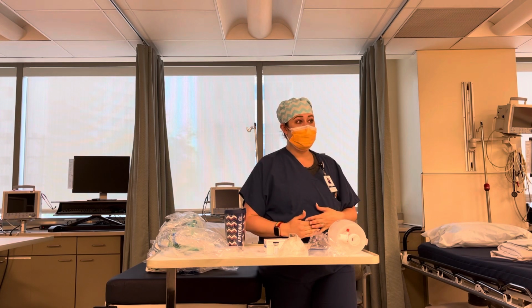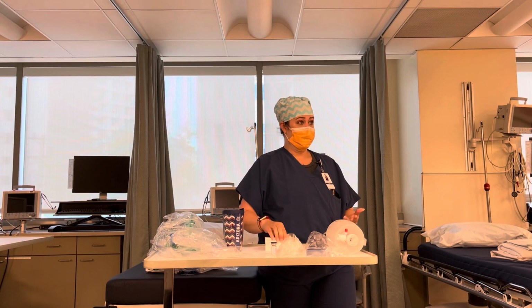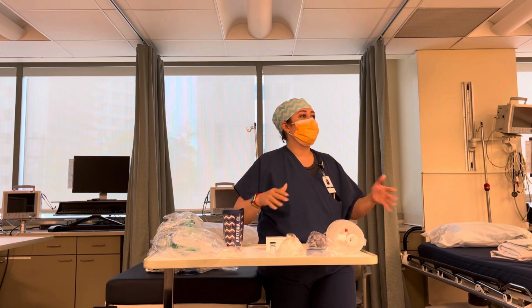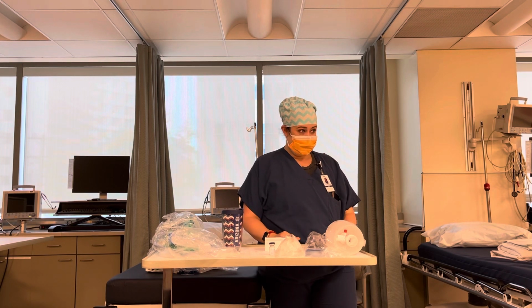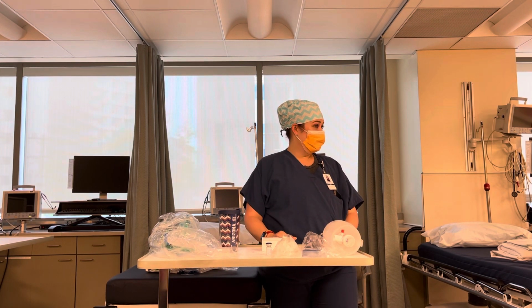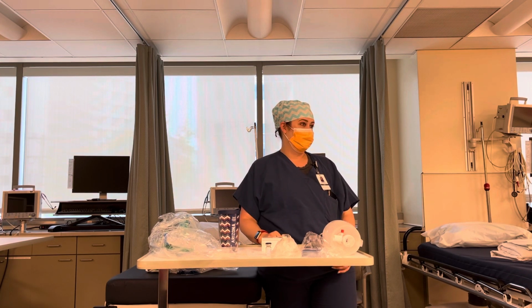emergency airway equipment things. And then yesterday, Julie asked for Rocuronium. Who can tell me what that is, where it's located? It's in the fridge on the clinic side. What do we ask? What is it? What does it do?